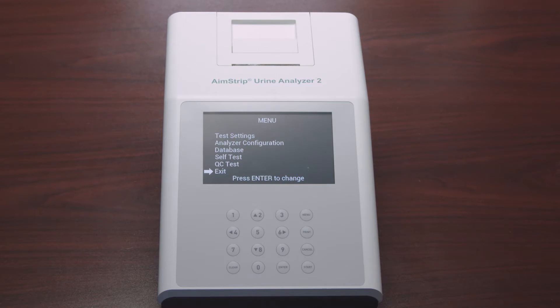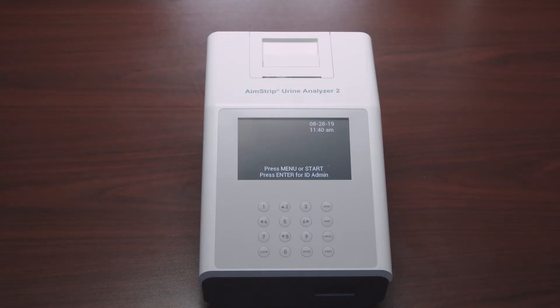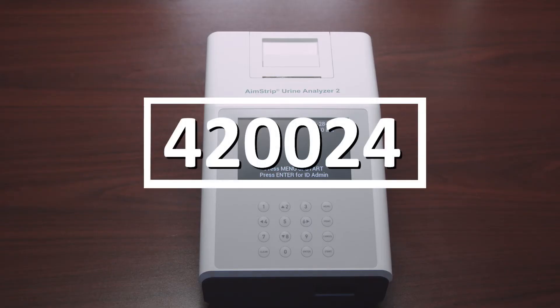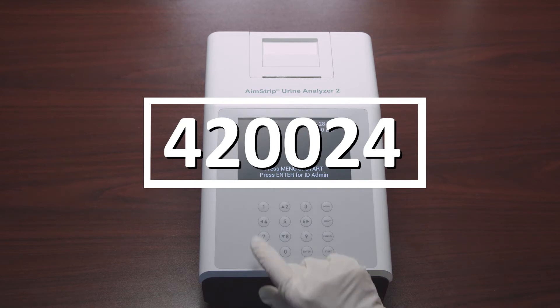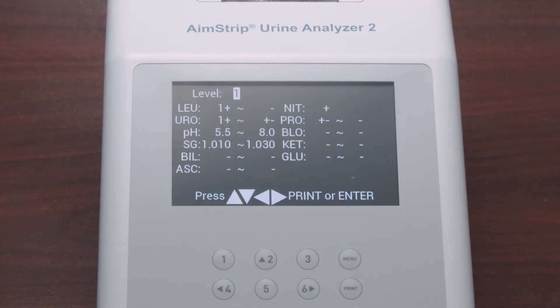The last option in the main menu is QC Test. Select QC Test and press Enter, then select Run QC Test and press Enter to perform a QC test before the next scheduled test time. If the QC values have not been set up, the analyzer will show a prompt to return to the initial screen to set them. From the initial screen, enter the passcode 420024 to display the QC value setup screen — this screen only recognizes arbitrary values.